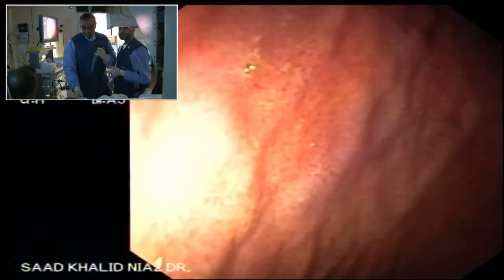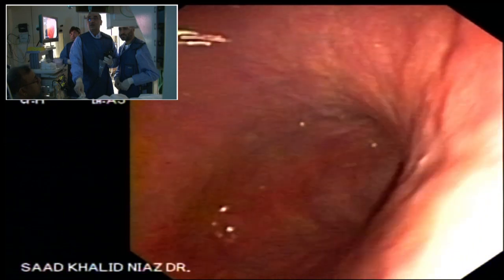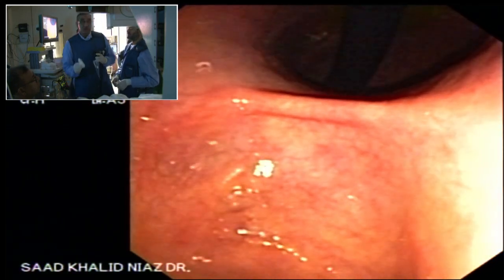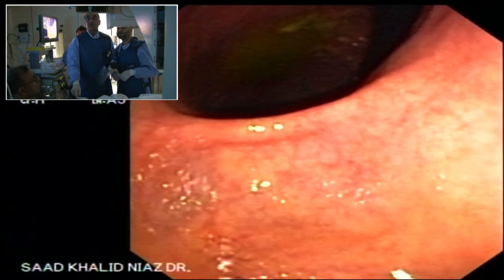So the thing to do is, you should be relaxed. If the knobs are locked, let me get it back into neutral position. See, when you enter the stomach, the scope is going to be like this, and you're never going to be able to get a better position. Straighten the scope, okay? Follow the gastric fold, right? Like that. I'm not twisting the scope, I'm not like this, okay? So just be normal, right? Let me show you. Just go neutral, right? You can see the pylorus there. Just intubate.